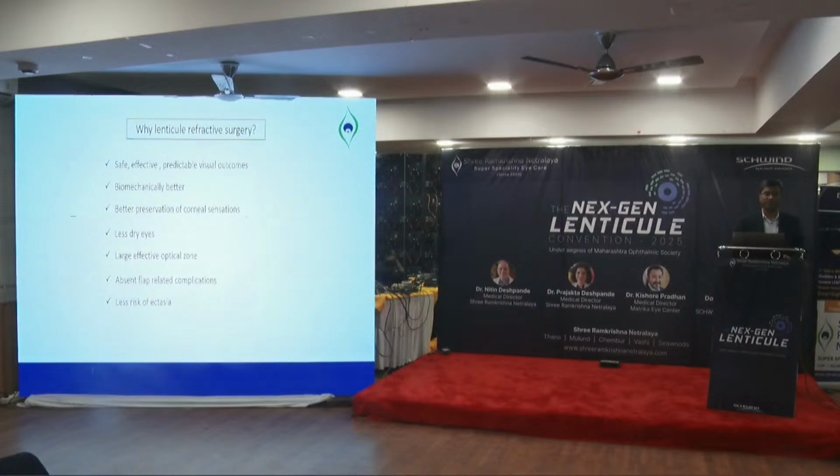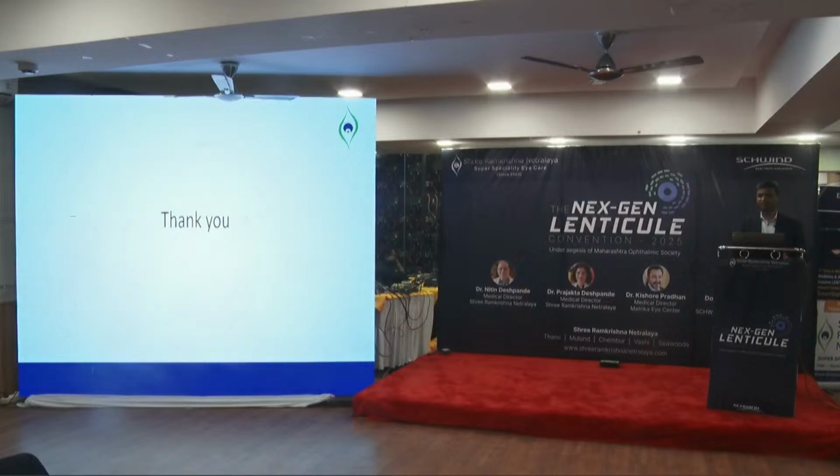Basically, it's a safe, effective, and predictable visual outcome compared to its counterpart, femtosecond LASIK. It is biomechanically much better, and there is better preservation of corneal sensation and less dry eye. It has a large effective optical zone, it has no flap related complications, and there is the least risk of ectasia. Thank you.